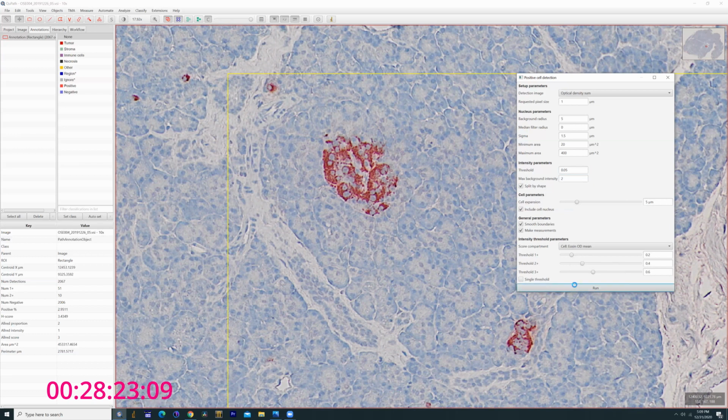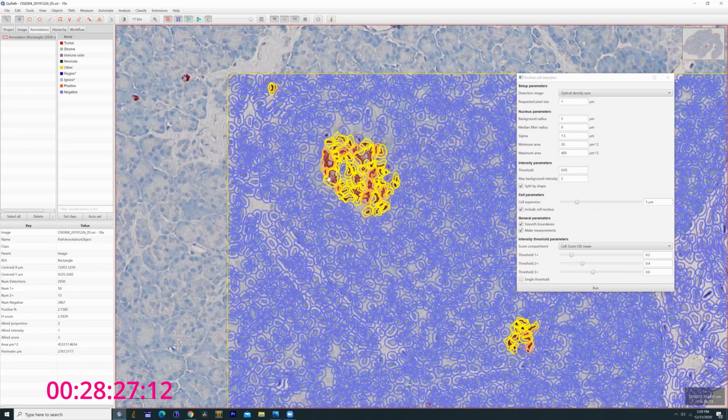And then hit run. And then look at it, and okay, there we go. Now the software is seeing those nuclei. It's seeing these, or trying to see the nuclei within the actual islet. Now, this is the part where it's a bit subjective, okay? With all this stuff, there's always a little bit of where do you define your cut points.